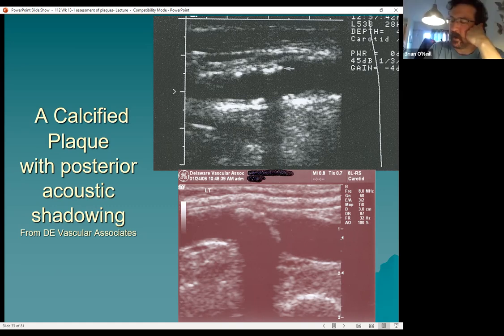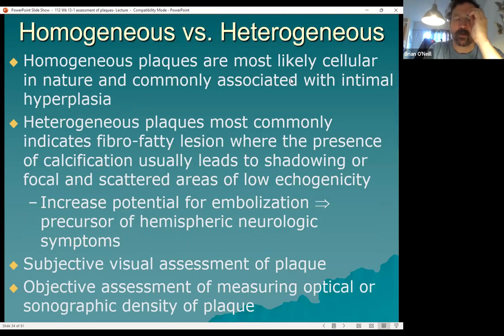Because I know that word is used a lot in the findings from the vascular lab: a moderate amount of diffuse plaque. Right, so if you have plaque in your CCA, plaque in proximal and mid CCA, plaque in the bulb, plaque in the ECA, ICA, that would be diffuse. It's throughout the entire carotid system, multiple areas of plaque rather than a single focal stenotic lesion.